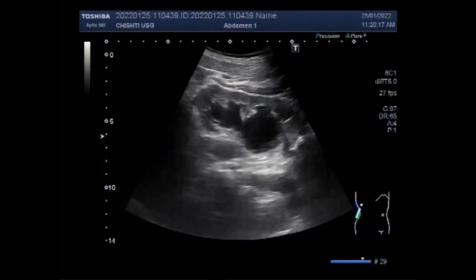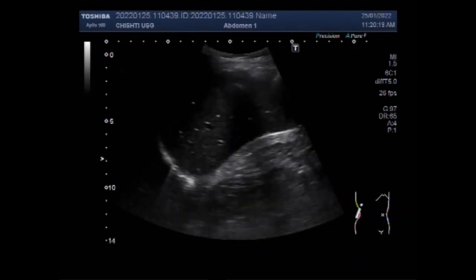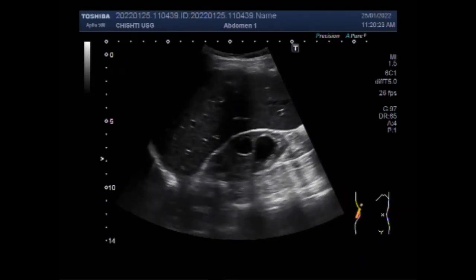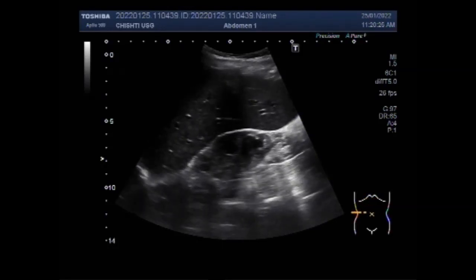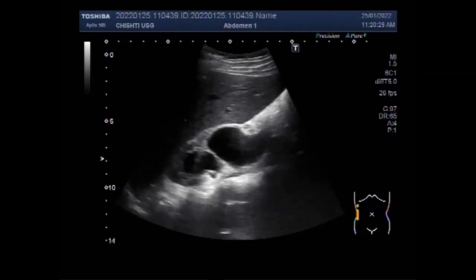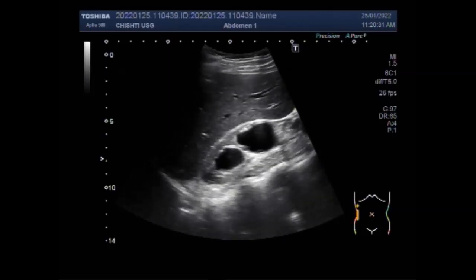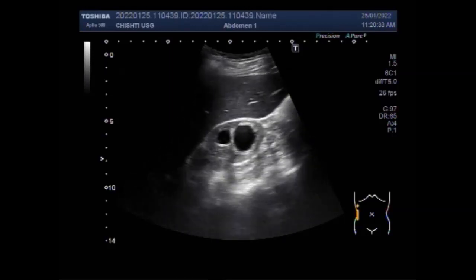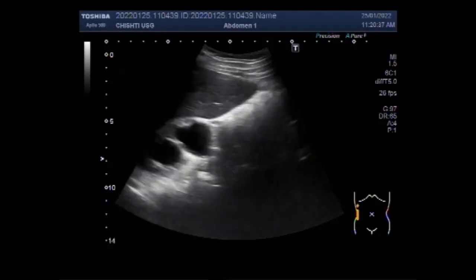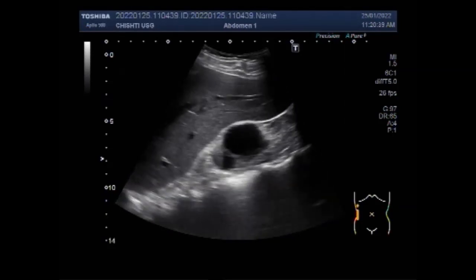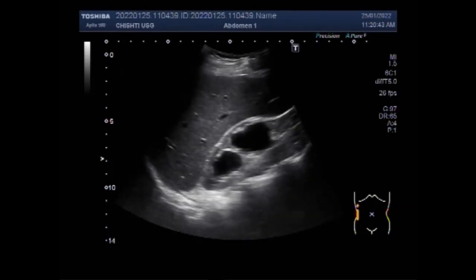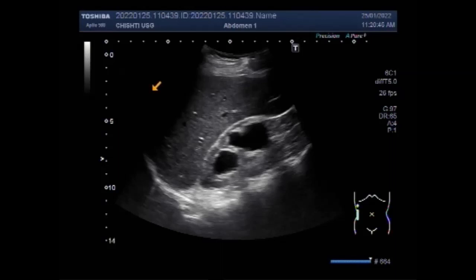Dear viewers, I hope you are all fine. This ultrasound video shows a case of uretero-vesical junction obstruction causing hydronephrosis and hydroureters. Two stones are also seen in the distal portion of the ureter. You can see the right kidney showing moderate to severe hydronephrosis with hydroureter.